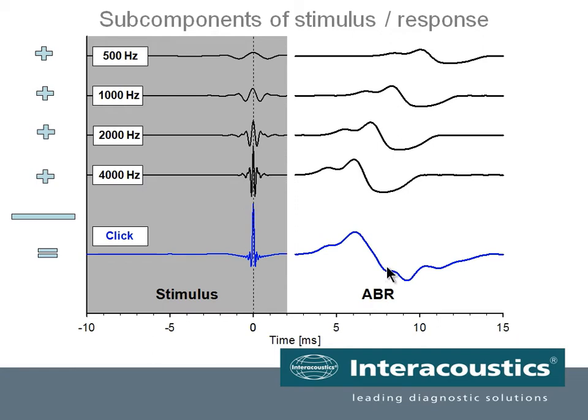But by analyzing it the way we have done here, we can see how these are actually not too well synchronized as far as providing maximum response down here when we add them together. And this is what we will try to look at with the new stimulus.